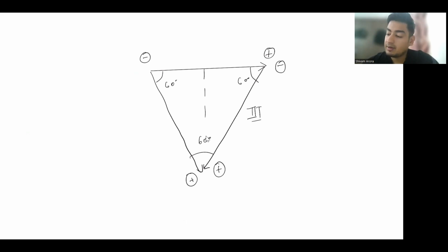Then a lead perpendicular to lead 1 facing downwards is lead AVF. A lead perpendicular to lead 3 facing towards the right upper limb is lead AVR. And a lead perpendicular to lead 2 facing the left upper limb is lead AVL.